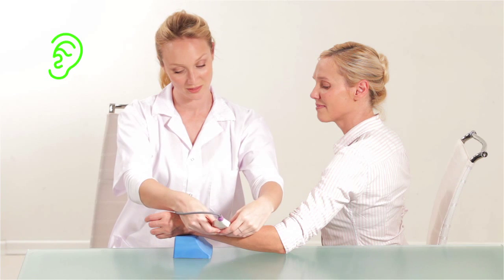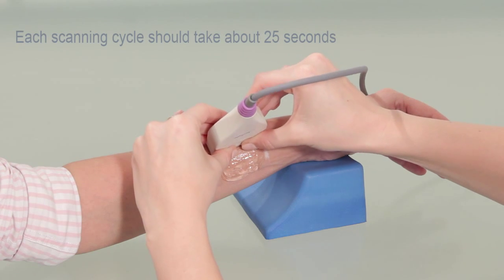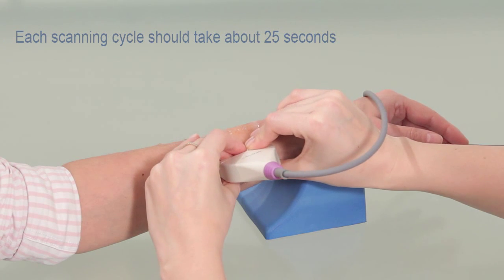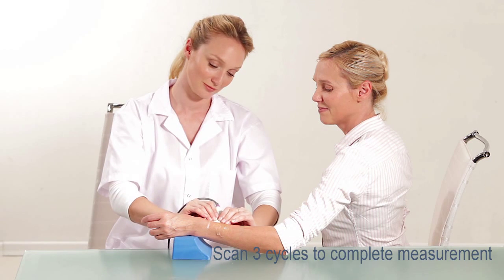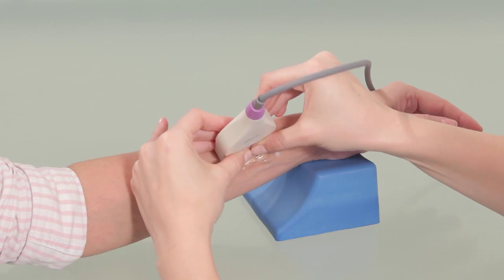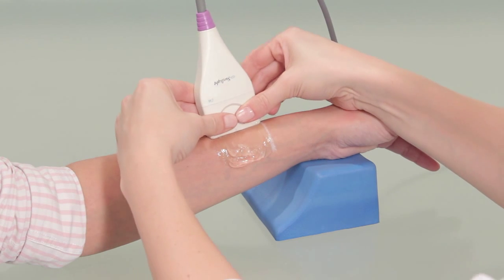A beeping sound confirms that you are measuring correctly. Each scanning cycle should take about 25 seconds. Scan three cycles to complete the measurement. If the information is insufficient, the system may prompt you to perform up to two extra cycles.